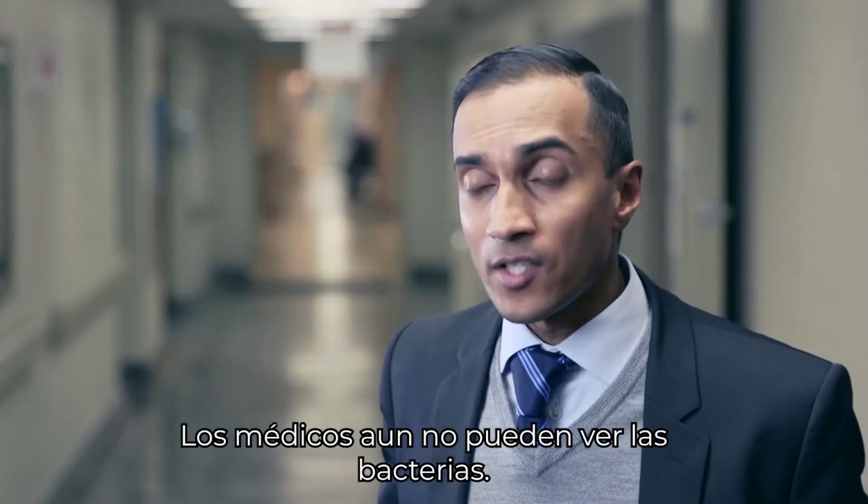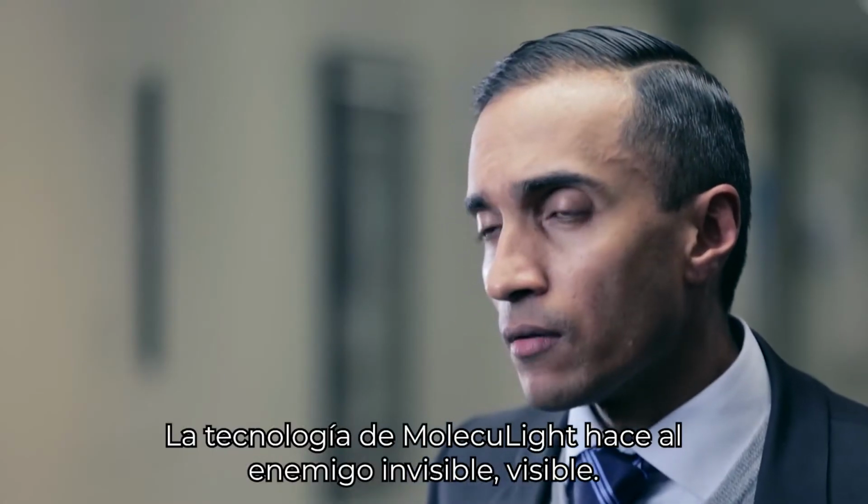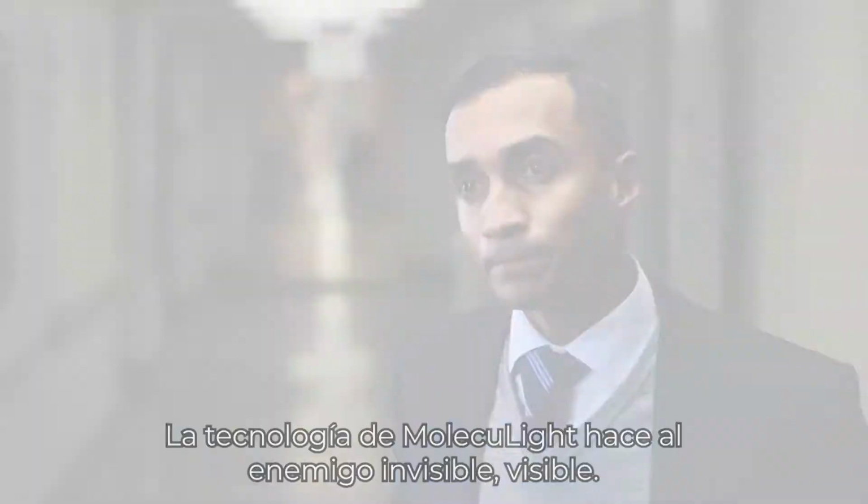Clinicians still can't see bacteria. MolecuLight's technology makes that invisible enemy visible.